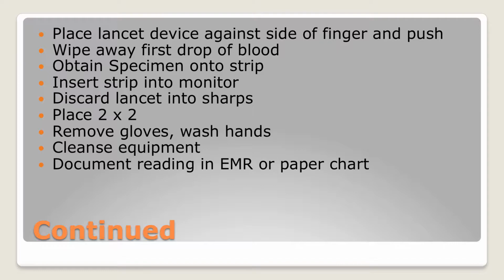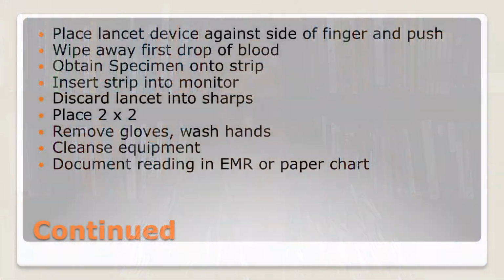Take off your gloves, wash your hands, wipe off the equipment. It's important to wipe off that equipment between each patient so that you're not carrying bacteria from one place to the other. And then document your reading in the electronic medical record or in the chart.